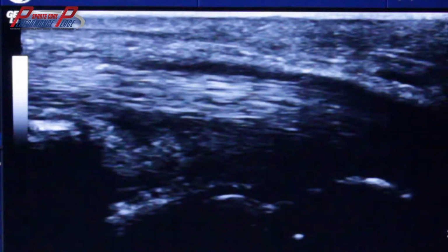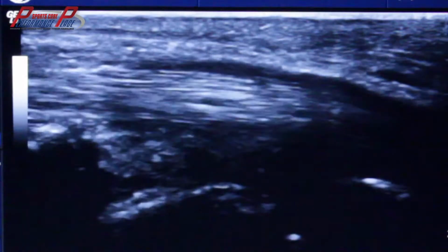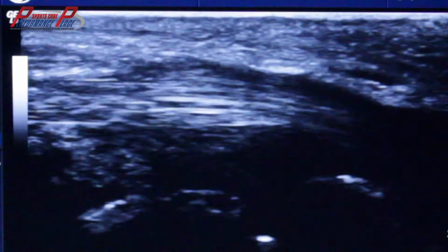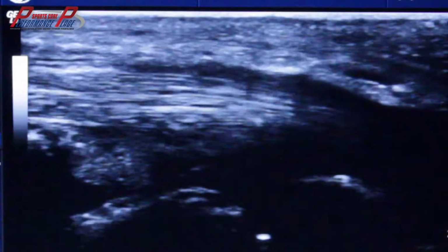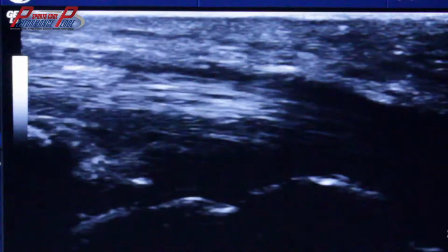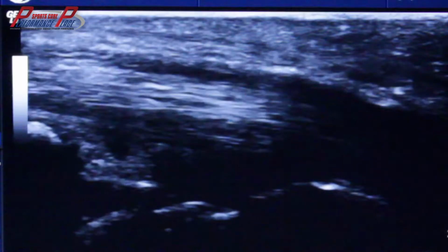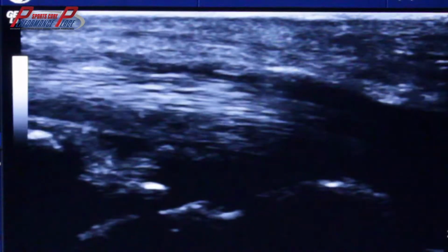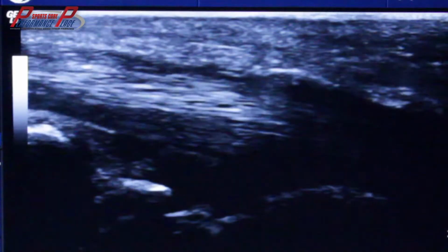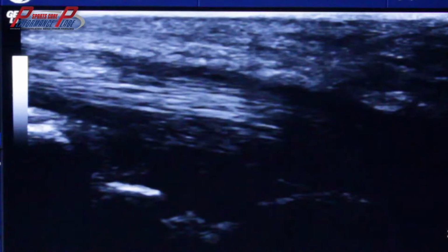So I'll tell you what I'm going to do. I'm holding the transducer right on that one spot. I'm attempting to not move my fingers. I'm going to leave them in the extended position right here. I have my elbow on a table, and my neck is going to be tilting away. I'm going to depress the shoulder. And notice that area of black on top starts to pull towards the left of the screen. And now I'm relaxing. It's going to pull towards the left of the screen. Right.